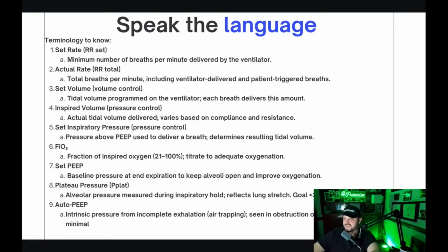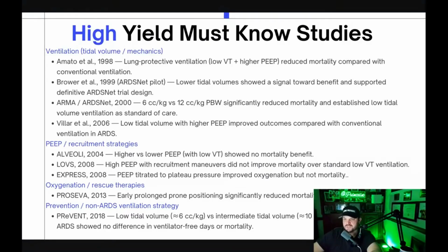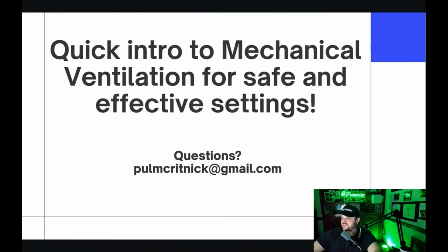So I just put that in there. It's not to intimidate anyone. I put in some studies here. These are the big ones, or things that can get you off the ground if you're learning mechanical ventilation, in the sense of ARDS and setting low tidal volume settings and that stuff. This isn't at all meant to be an exhaustive list. It's just somewhere to start. All right, so this was a quick intro to something profound.